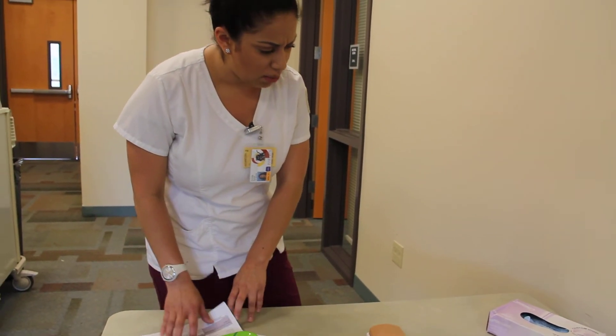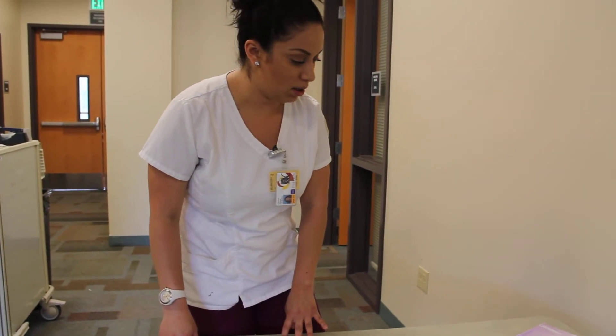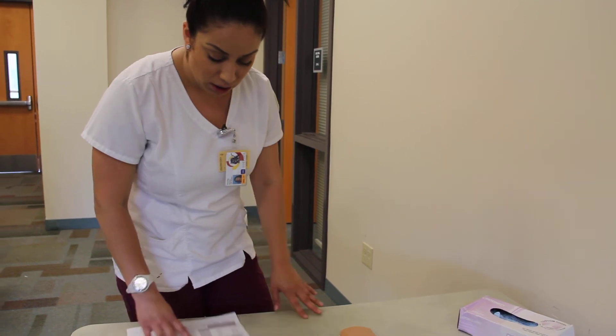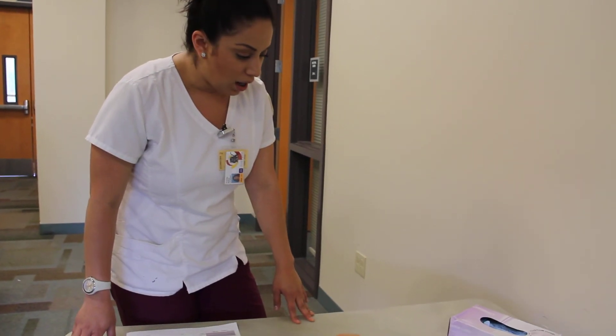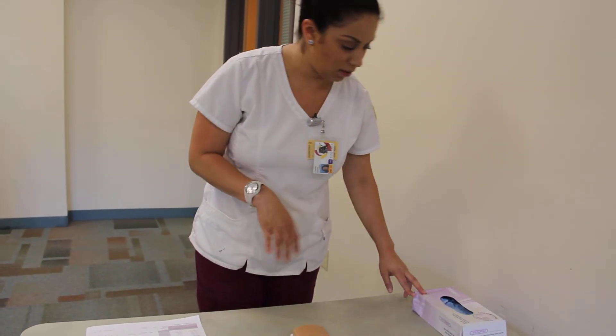Are you experiencing any pain at the moment? On a scale of 0 to 10, 0 being no pain and 10 being obviously the worst pain — zero? Okay, great. I'm going to go ahead and wash my hands and put on some gloves.